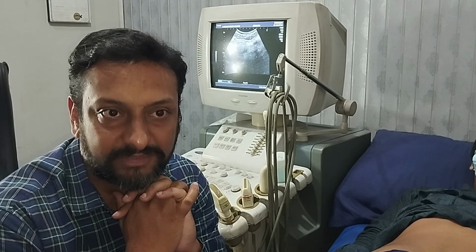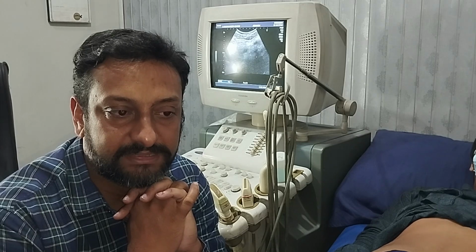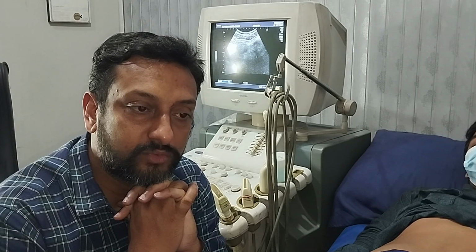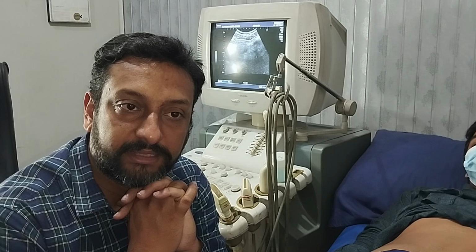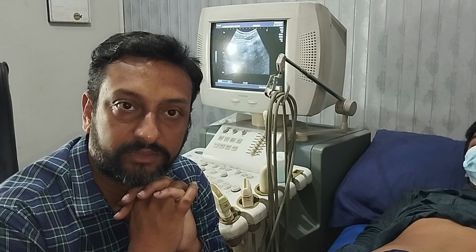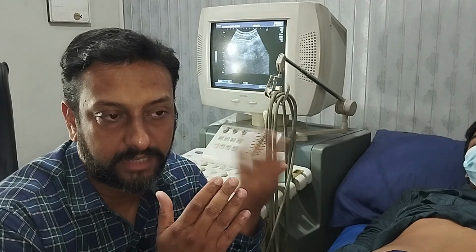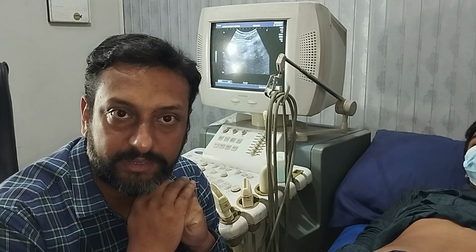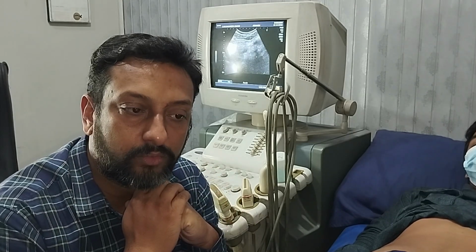We have to look for any mass within the pancreas, and we also have to look if there is any pseudopancreatic cyst or pancreatic pseudocyst. Pancreatic pseudocyst is the collection which gathers around the pancreas when there is acute inflammation. Most of the time, it resolves spontaneously, and it will appear as a cyst-like structure anterior to the pancreas. It could be anterior to the head, body, or tail of the pancreas, or covering all of the pancreas on the whole.